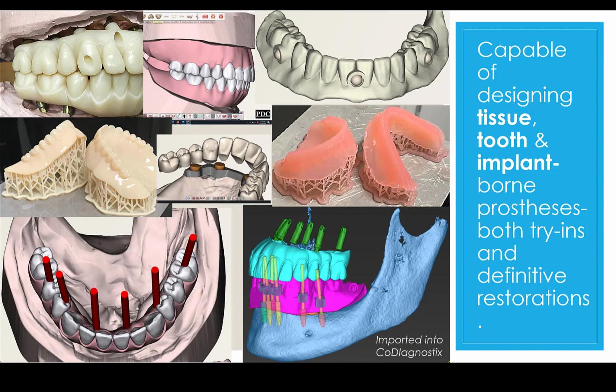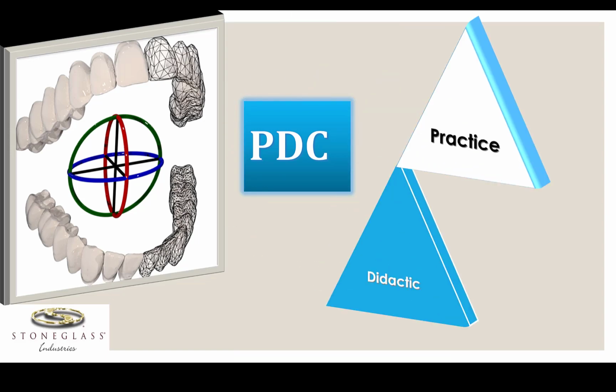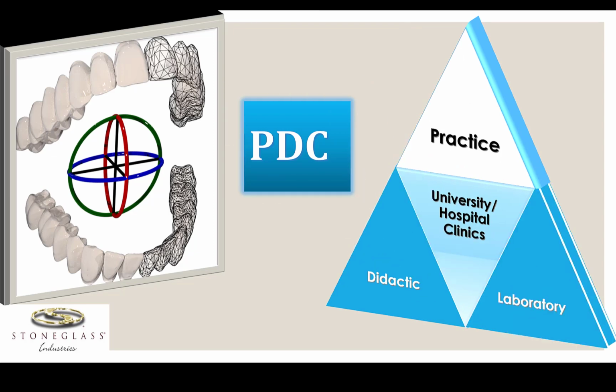Finally, it can be used in the academic and clinical realms, both in universities and in private practices. The flexibility of the software affords a seamless transition from preclinical to clinical realms. PDC can be used in the classroom where a case to work up can be deployed to an entire class at once, and it can be used on the clinic floor with patients.